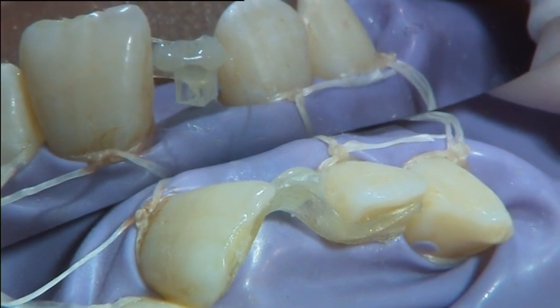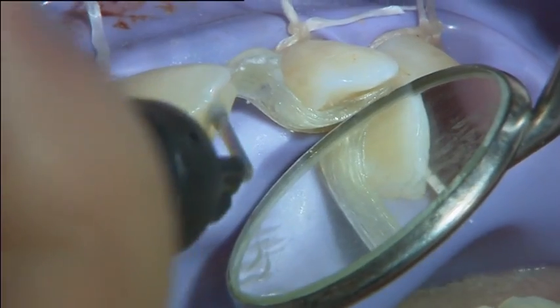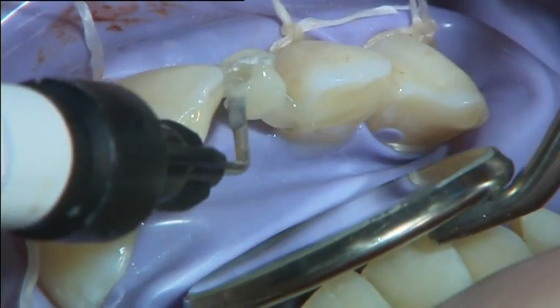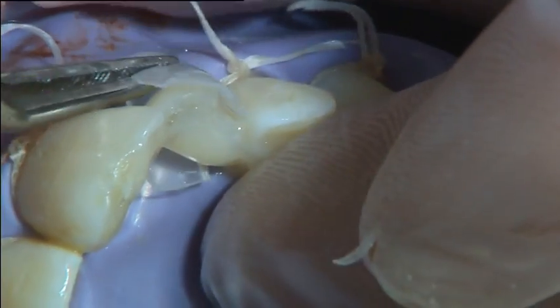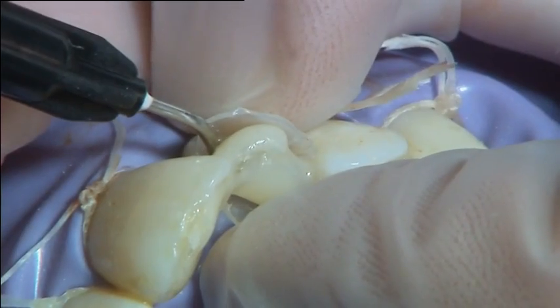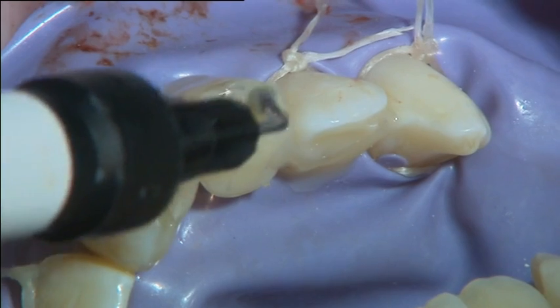The initially cured fibre frame was completely covered with flowable composite. A pontic base form was placed to shape the cervical part of the pontic. The pontic was built up using composite according to the composite manufacturer's instructions. In this case only flowable composite was used because of the open bite of the patient; normally a restorative composite would be used.